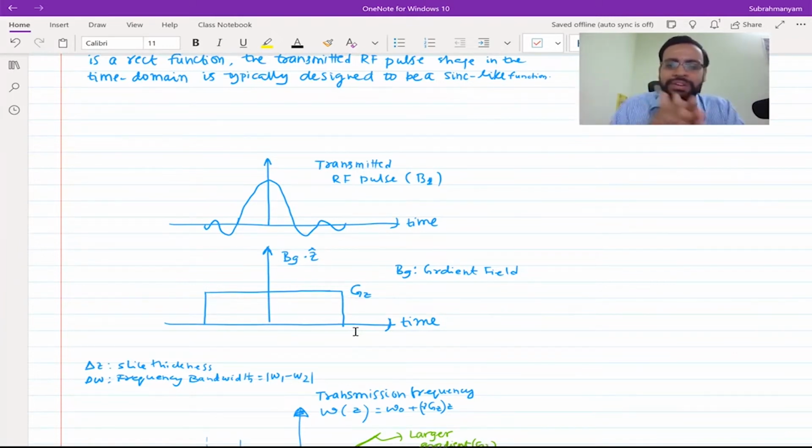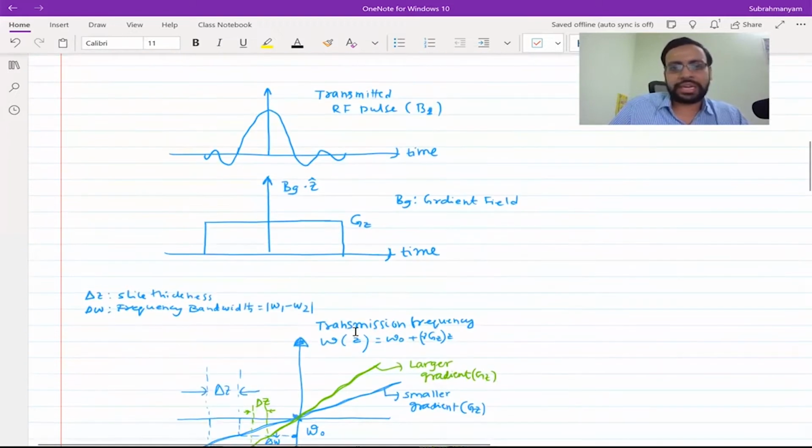That particular resonant frequency you have to give through this field. Looking at the quantum level, that's when the energy transfer would happen, because both of them are at the resonant frequency, and that's when it moves from one state to the other, causing all the effects that we have discussed earlier.